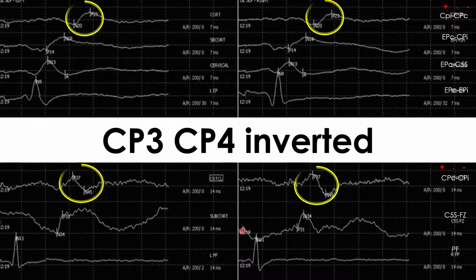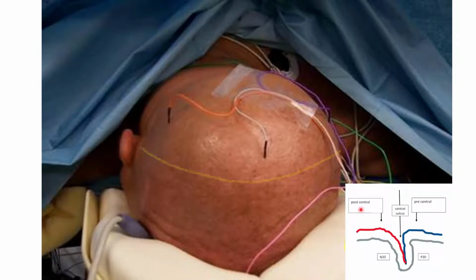What happens when the CP3, CP4 derivation of corticals is inverted in your upper SSEP as well as your lower SSEP? It's possible that you have your electrodes too far anteriorly. In this case, the hookup looks fine.